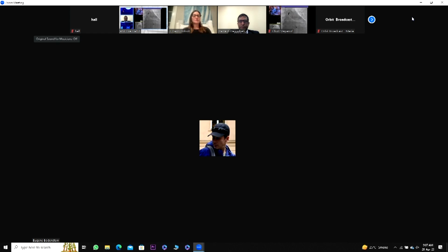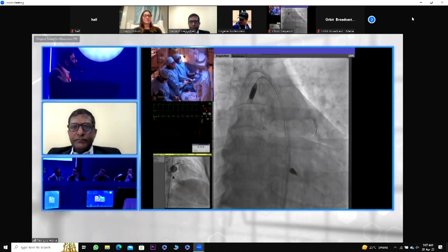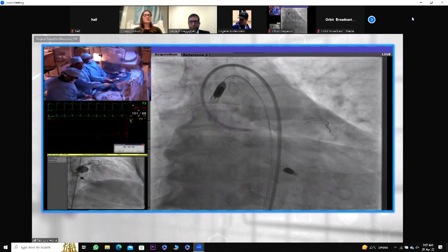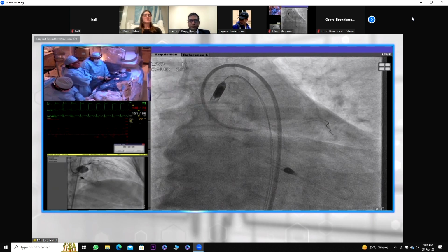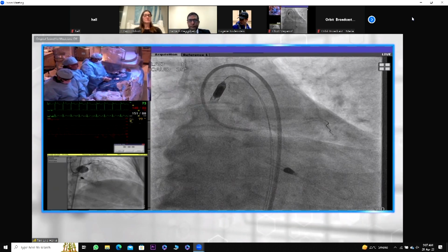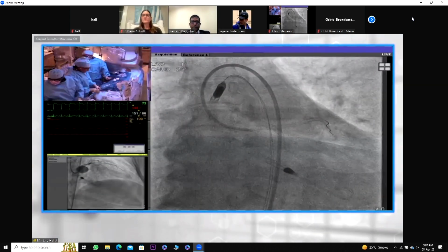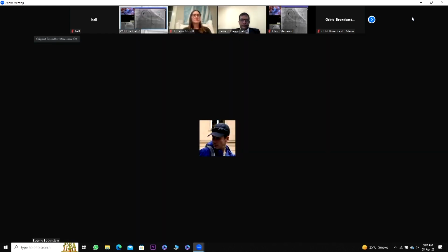Would you like to loop a second wire in the aorta for precise placement of the stent at the ostium and avoiding stent crush? I think Dr. Tariq Shafi has a question. Just to avoid the guide getting into the ostium of the left main, he is asking if you can place a second wire and make a loop.